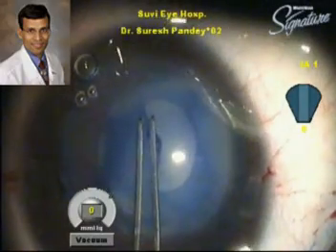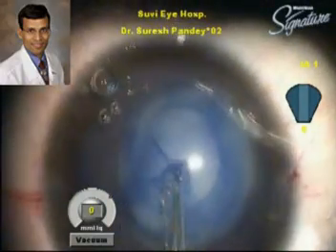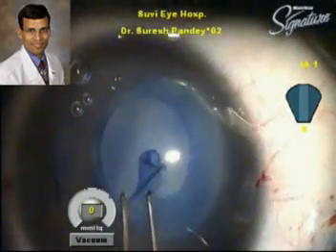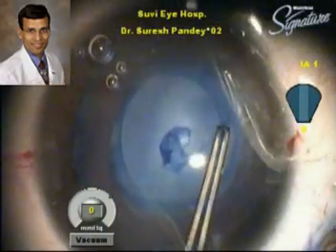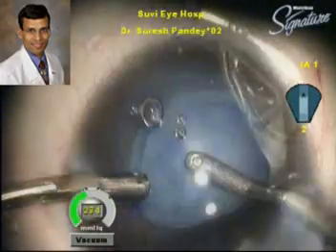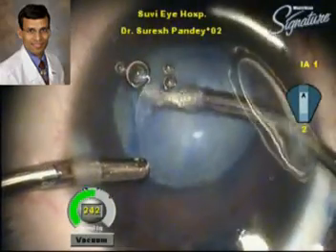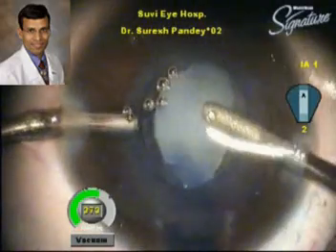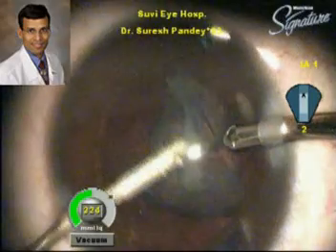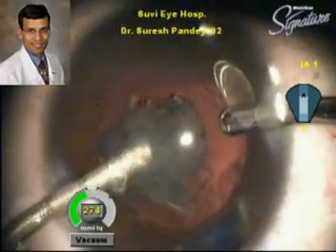It is important to pull the capsule in a centripetal manner and to re-grasp the capsule again and again so that we intend to perform a small rhexis. Otherwise, it ends up becoming larger than intended. So always follow a centripetal motion and re-grasp the capsule often. Because these cataracts are very soft in these small children, they can usually be aspirated using irrigation aspiration.